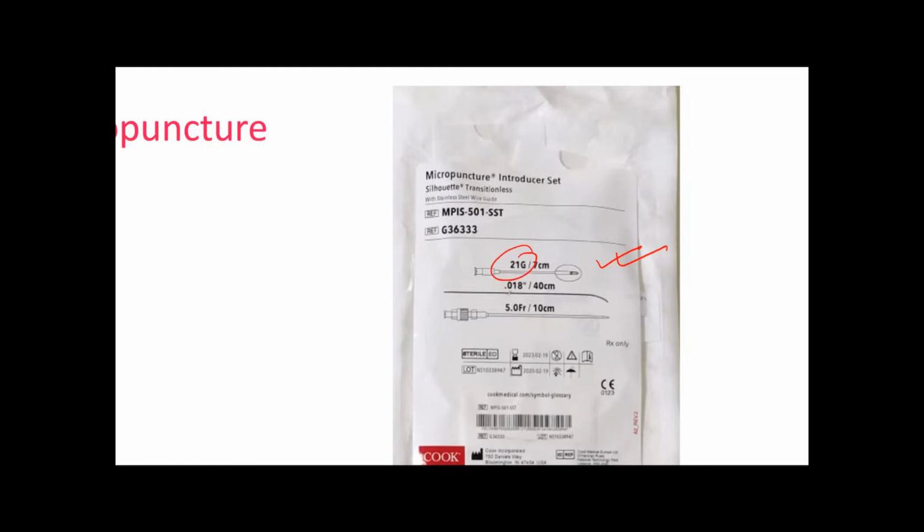This 21 gauge needle is very thin, and it's compatible with an 018 wire.